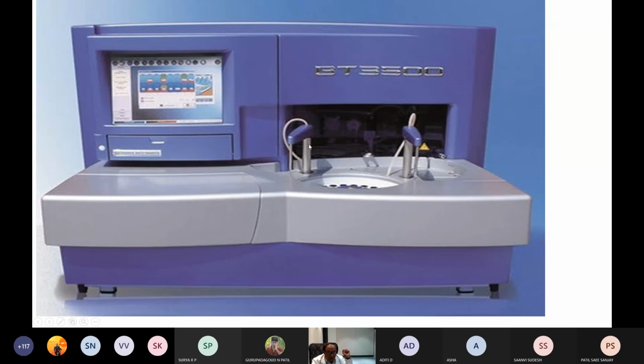By that time, this probe will move automatically and take the reagents that are kept at this portion inside. Separate compartments will be there. In every compartment, everything is programmed automatically. The reagents will be kept here, and it opens and dips there and takes up whatever amount of reagent, which reagent should be taken, and it knows very well which sample is in which cuvette. It dispenses the reagent in that one. So mixing will also be done there, and the reading filters will be kept here.